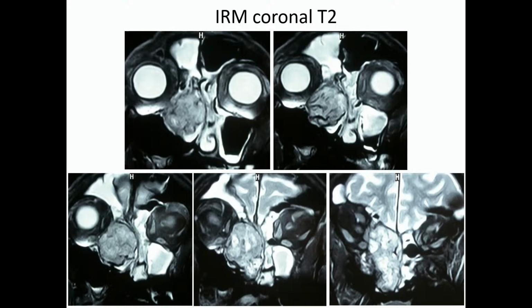But I take the opportunity to stimulate your knowledge. Because, as you can see, inside the tumor, you see sinuous formations with a signal void. This is not a signal of bone because, as you can see on the CT scan, you haven't any piece of bone inside the tumor. But this is a particular semiology on MRI, which is named flow void. In fact, this is pathological vascular structures built by the tumor with rapid flow.